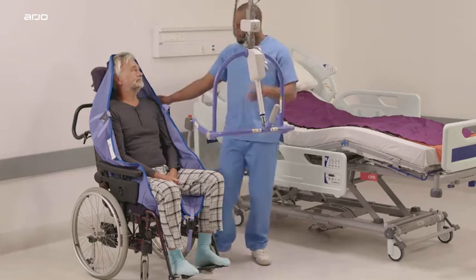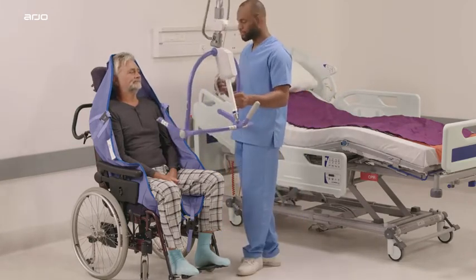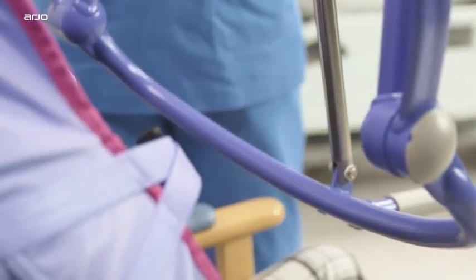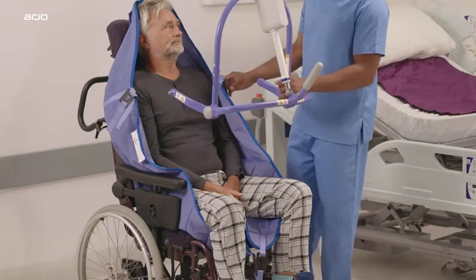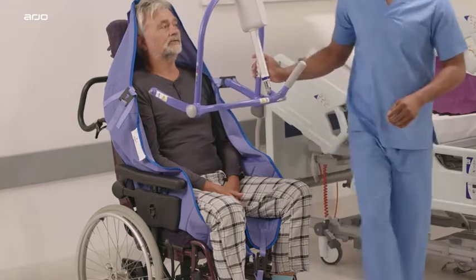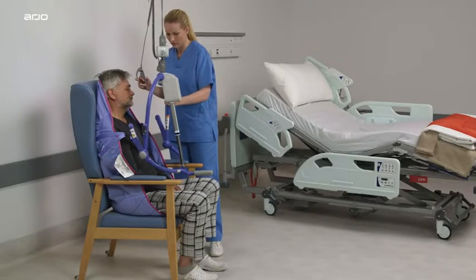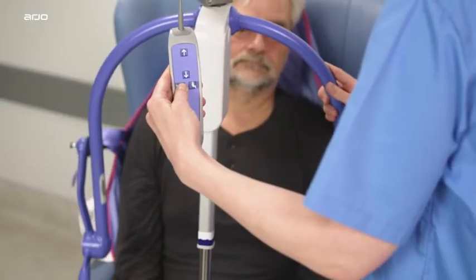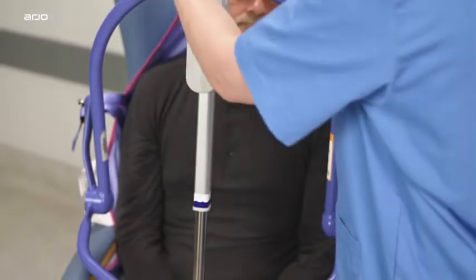Ensure the positioning handle on the spreader bar is facing away from the patient, and that the open part of the spreader bar is at or just below your patient's shoulder level. Ensure that the powered PDPS is lowered enough to be able to attach the sling's shoulder clips to the spreader bar. When ready to perform the patient positioning function, operate the PDPS control buttons on the handset to move the spreader bar into the required position.